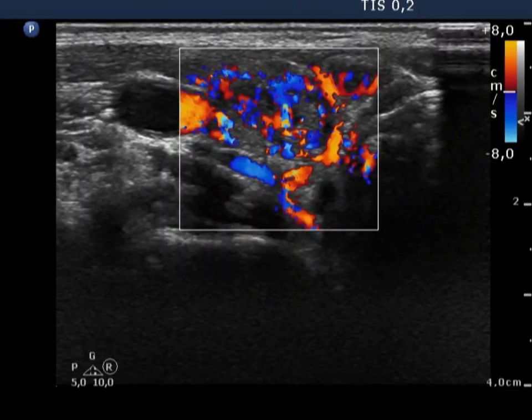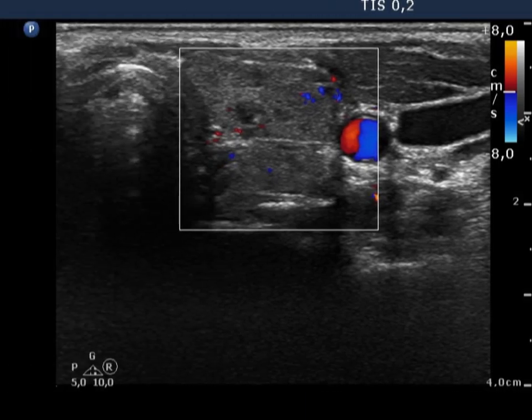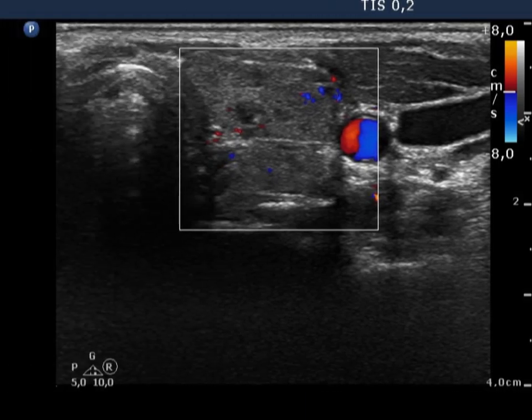The vascularization is significantly increased in the right lobe, while decreased in the left lobe.